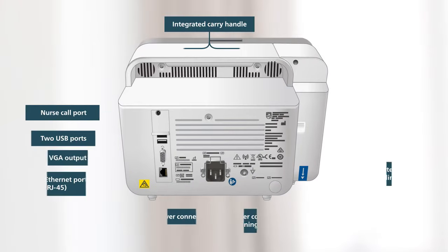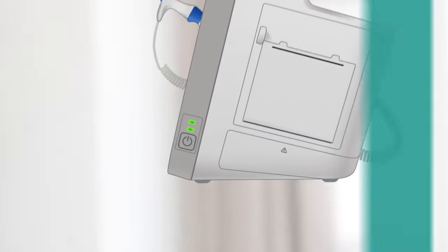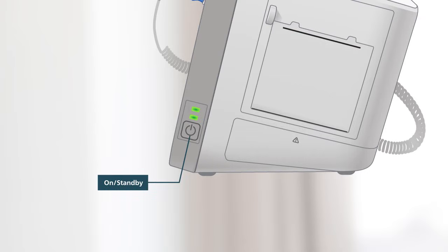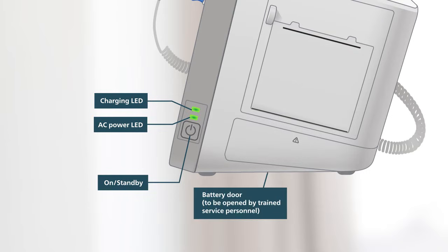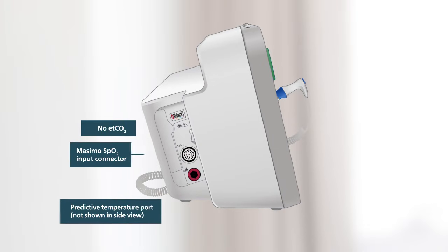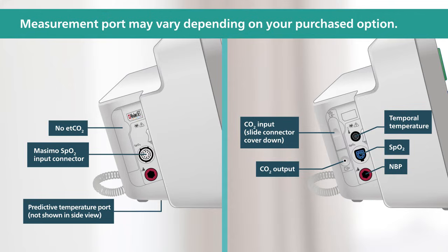The back of the monitor features the power connector and other helpful connection ports. The right side of the monitor features the on/standby button, dual LED indicators for power and charging status, and the battery door. Measurement ports are located on the left side of the monitor and vary depending on your purchased option.